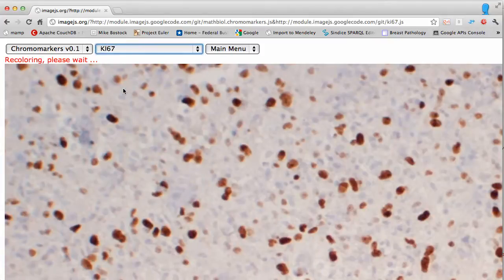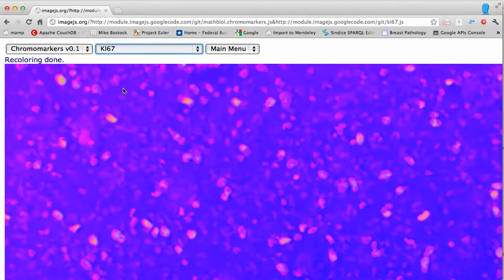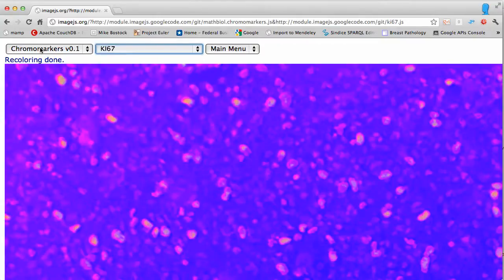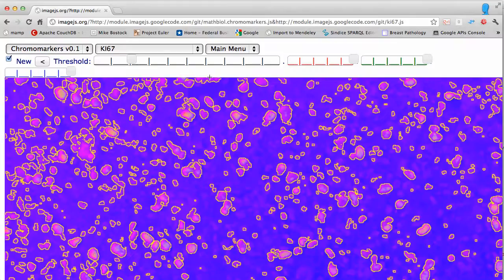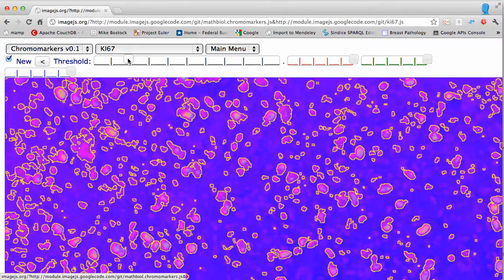The purpose of this operation is to separate all nuclei — whether ki67 stained or not — from the background. You can then go back to chromo markers, pick a region in the background, and try to segment the nuclei out. Some nuclei may still be missing, and you can bring them in by decreasing the value of the threshold.